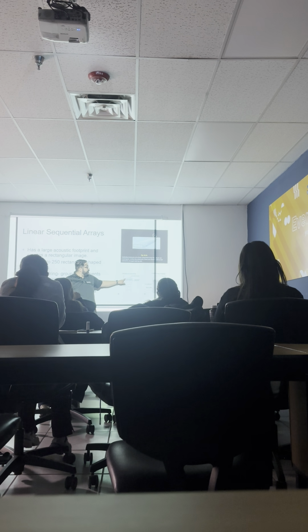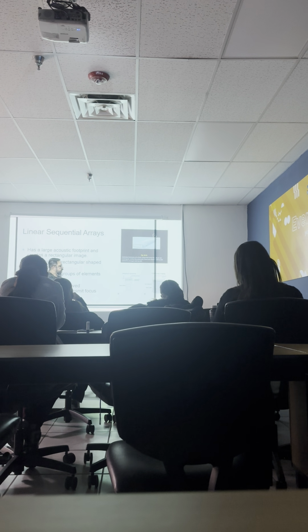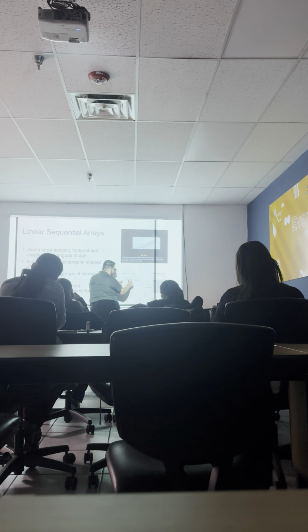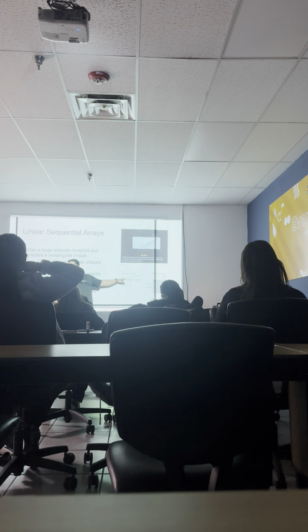If I made the firing pattern where these turn on fast and then these take longer to turn on, what happens to our focus? If our curve is more prominent, it's more narrow and more shallow. So our focus would be over here if our curve was higher. But this one isn't too curved, it's kind of flat, so that means our focus would be deeper.